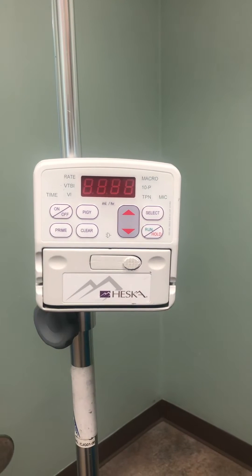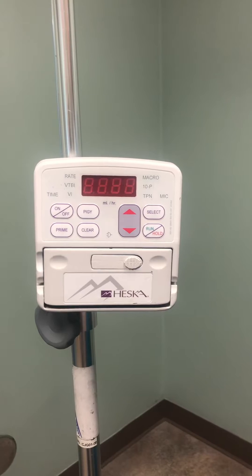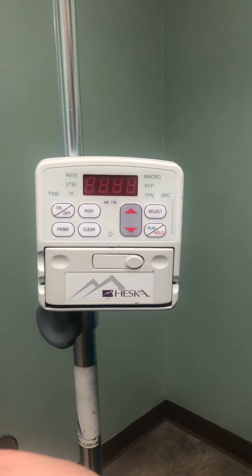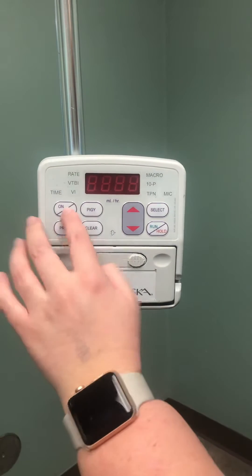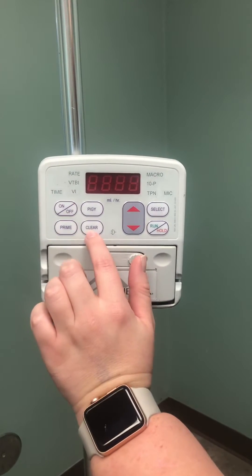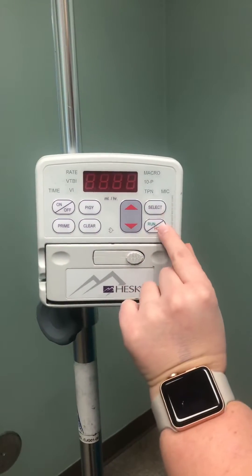Here we have our Heska pump, and today we are going to show you how to set up IV fluids. We have a couple of important buttons that I want everybody to know: this is the on and off button, this is the prime button, the clear button, select, run, and hold.